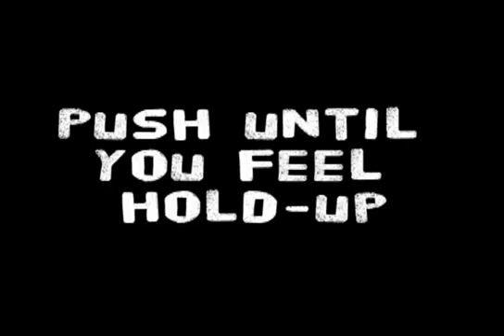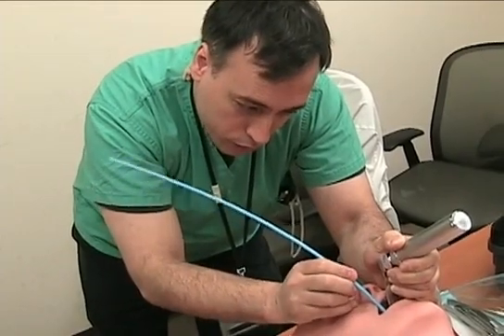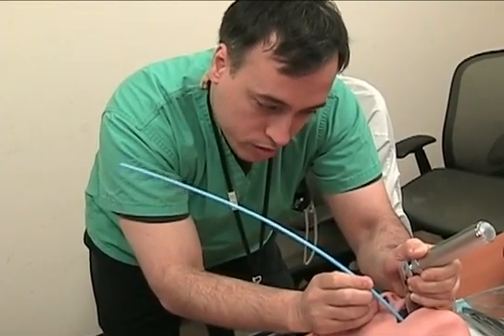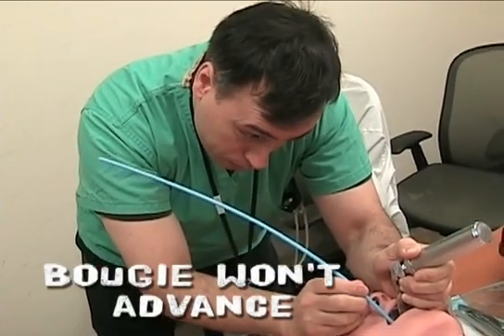Either you'll hit the carina or one of the branches of the main stem bronchi, and the bougie won't go any further — it'll stop at about 40 centimeters. If you're in the esophagus, on the other hand, it'll keep going; you could place that thing all the way to its hilt. So that's how you know.